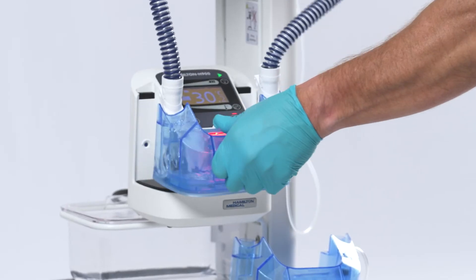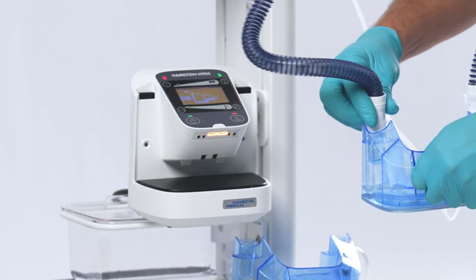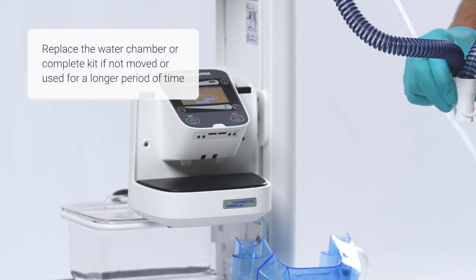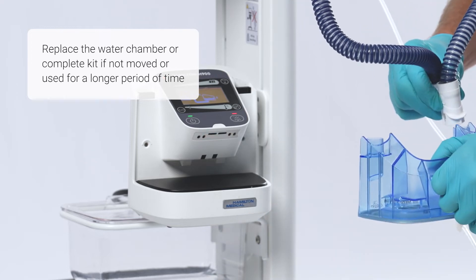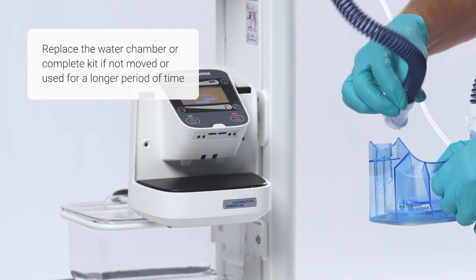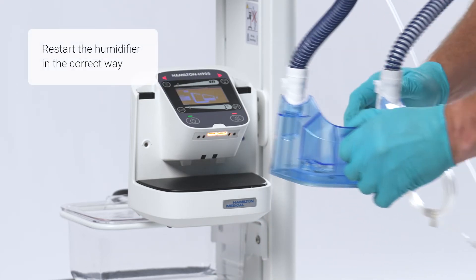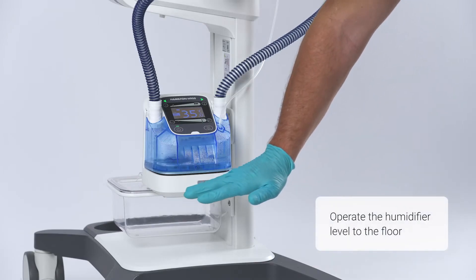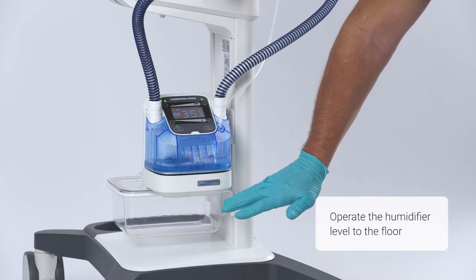If the water is at the right level and the alarm occurs again, you will need to replace the water chamber. It is advisable to replace the water chamber or complete kit if it has not been moved or used for a longer period of time. Note that the humidifier should always be operated horizontal to the floor.